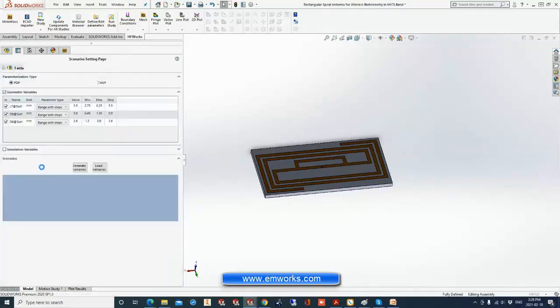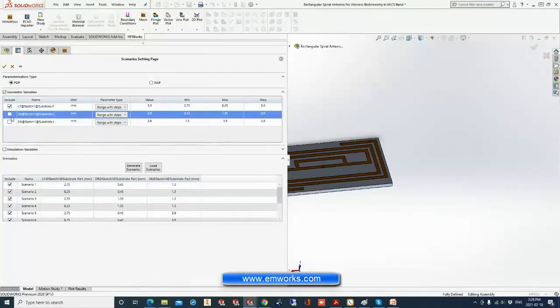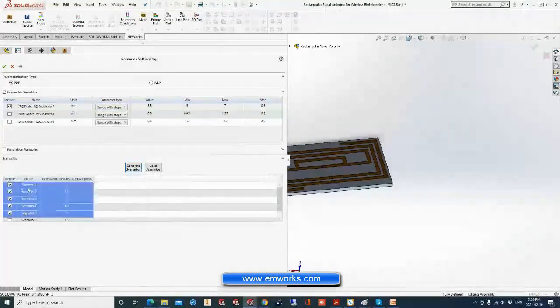Go to design scenarios. I already selected 3 parameters. I can uncheck the second and third one and keep only the length of the antenna, and I can define a minimum, maximum value, and a step. The default value is 5.5 millimeter. I can, for example, define a minimum of 5, maximum of 7 millimeter with a step of 0.5 millimeter and generate scenarios. So here we have 5 scenarios generated.